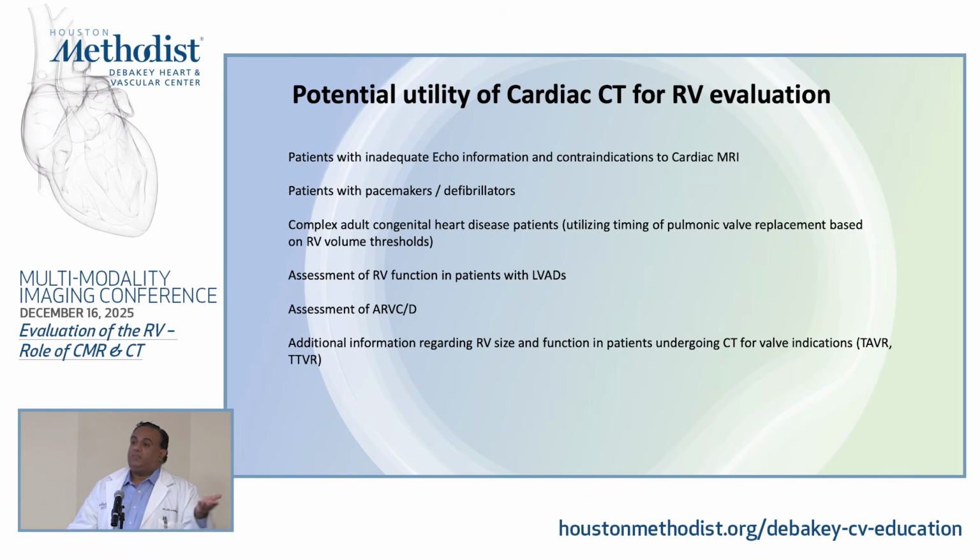Also, there is no normative data for CT for volumes and ejection fractions because there are no large studies that have looked at that. So we again borrowed that data from cardiac MRI. Assessment of RV function in patients with LVADs, because you're not going to do MRI on these patients, and I'll go through that. It can be useful in assessment of ARVD.